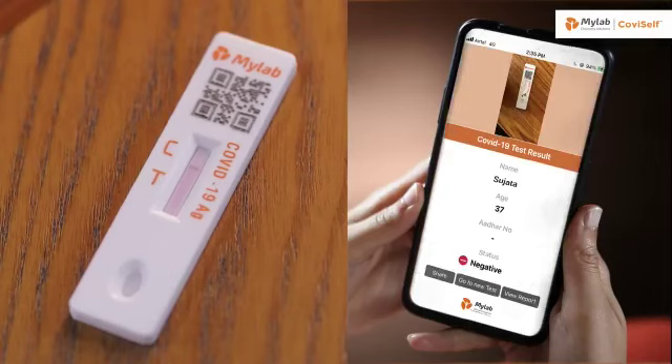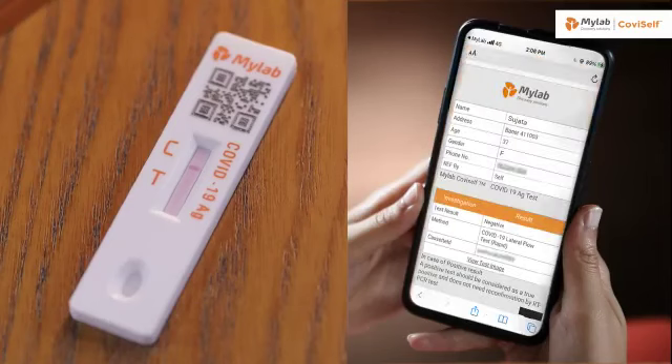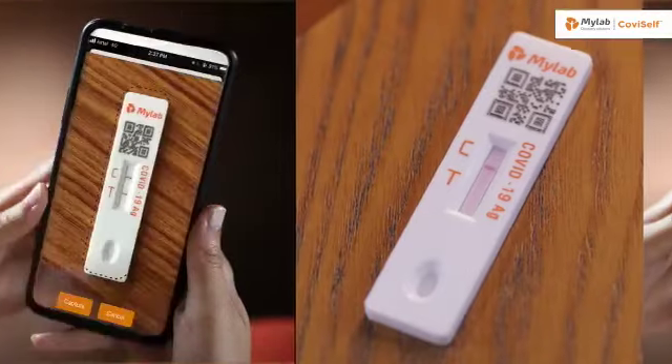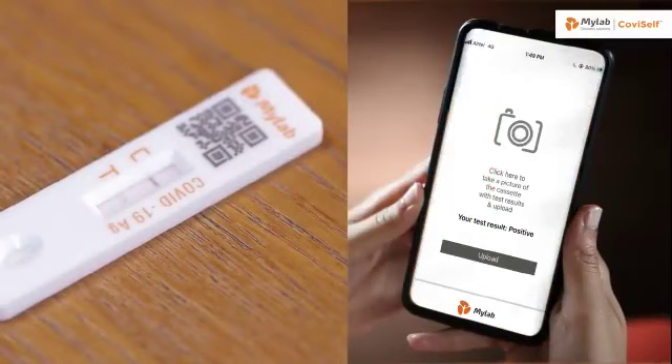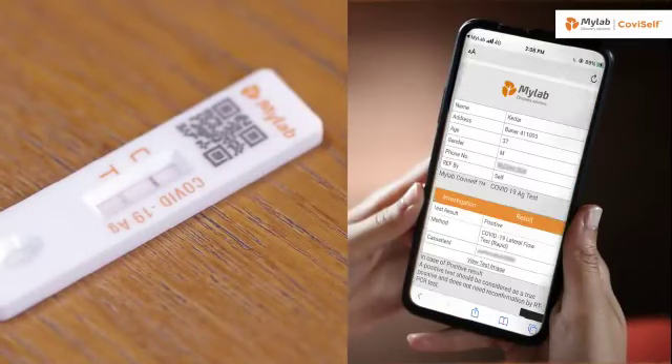For negative results, if there's only a quality control line C and no test line T appears, it indicates that coronavirus antigen has not been detected and the result is negative. For positive results, if both the quality control line C and test line T appear, coronavirus antigen has been detected and the result is positive.